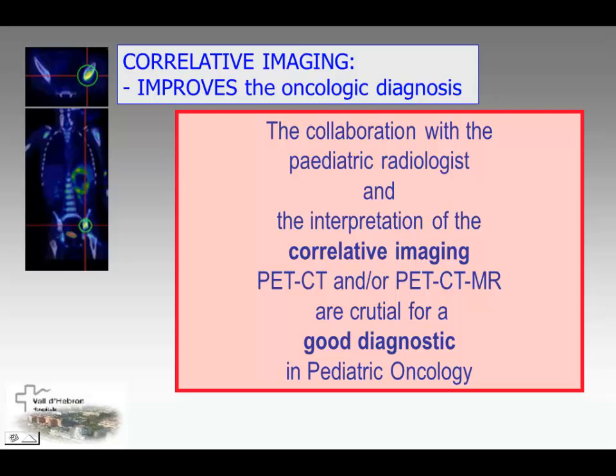At diagnosis and during the evolution, your neuroblastoma can have high, medium, low or no uptake at all of MIBG. In cases of low or no uptake, it is advisable to perform PET with FDG.